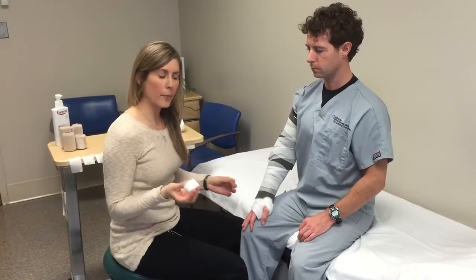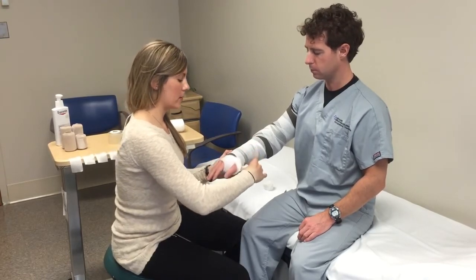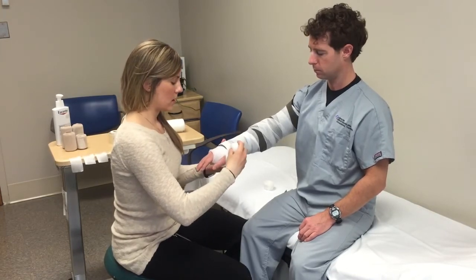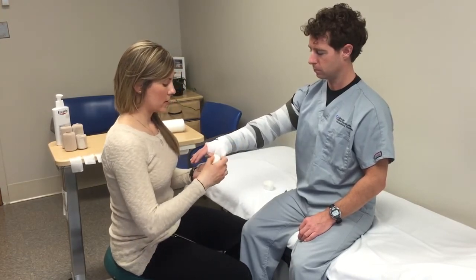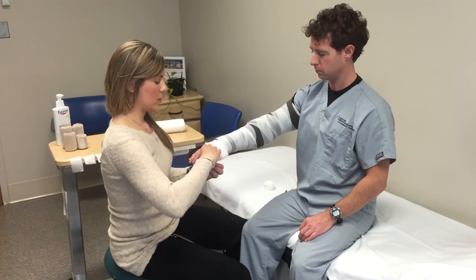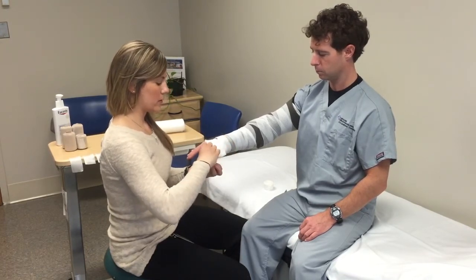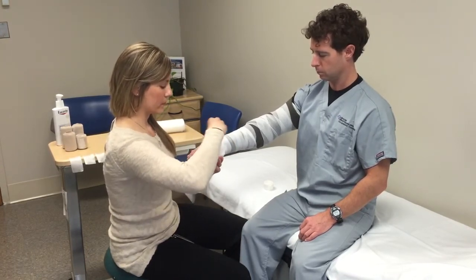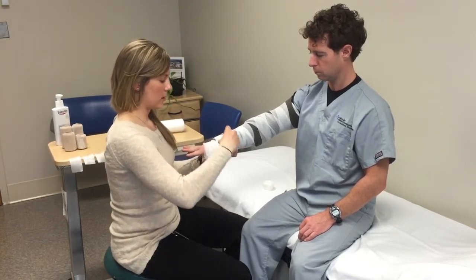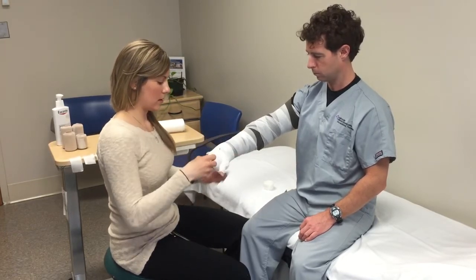Now you can apply the finger wrapping. Anchor at the wrist and wrap around at least once, then go towards whichever finger is convenient — in this case it's the thumb. You just want to ensure full coverage and that you're not pulling too tight. Wrap all the way up and back to the wrist; you can go all the way around again if you need to secure it, and then back down.